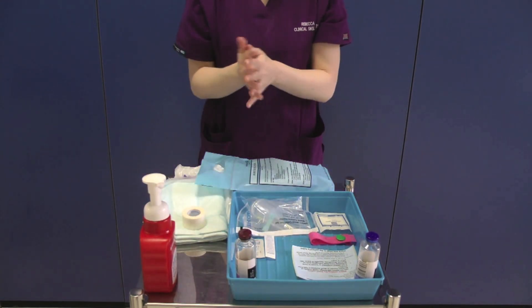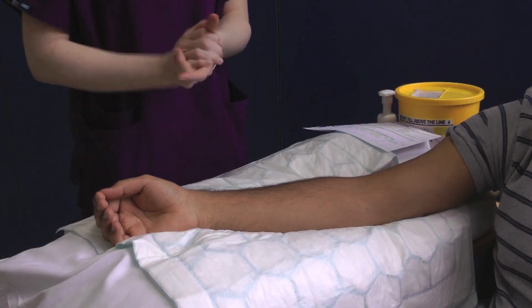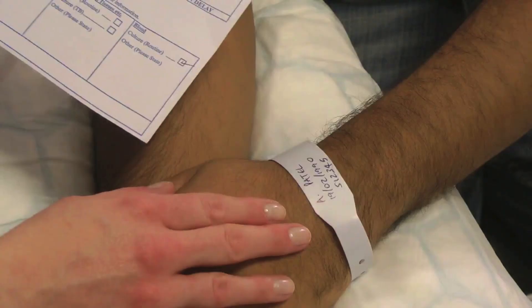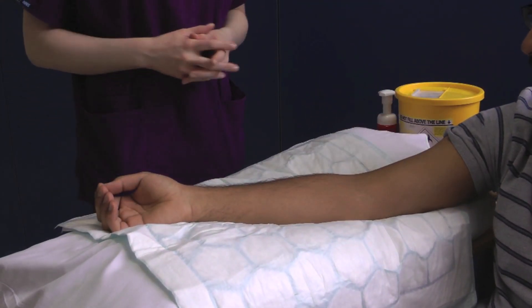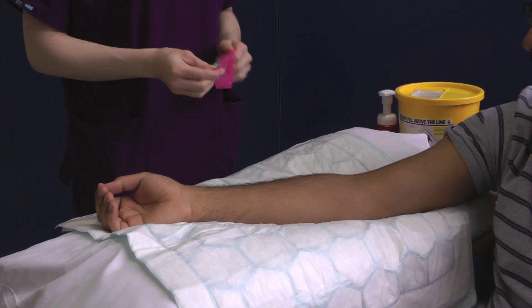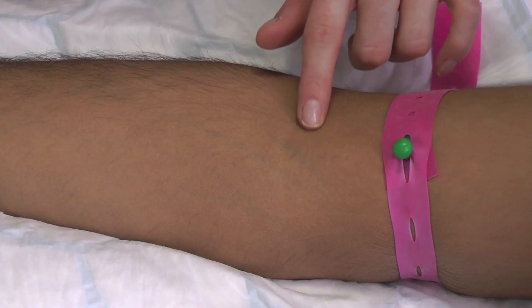Once you have done this, decontaminate your hands and proceed directly to your patient. At the patient's bedside, decontaminate your hands and reconfirm the patient's identity against the blood culture request form. Make sure that the patient is happy for you to proceed and position them so that they are comfortable, ensuring your equipment and sharps bin are within easy reach. Apply a disposable tourniquet to the patient's arm and palpate for a suitable vein. Once you have located the vein, release the tourniquet.